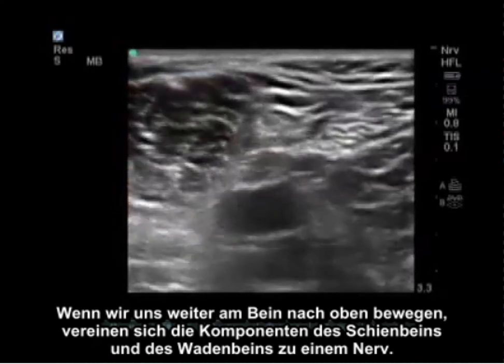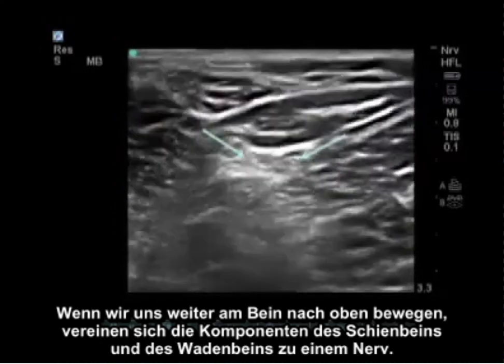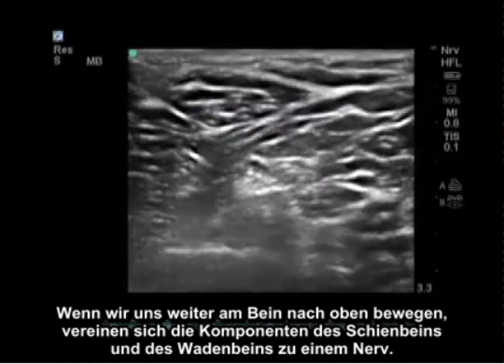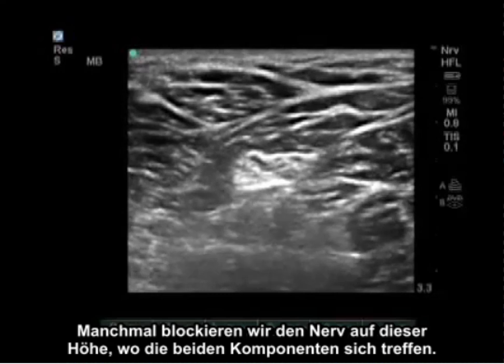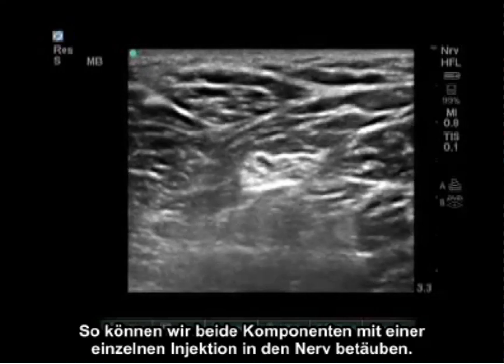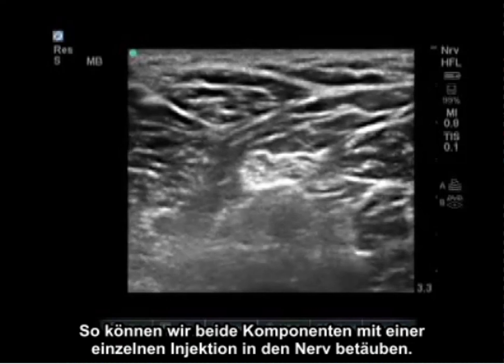As we keep going up the leg the tibial and peroneal components join into one nerve. Sometimes we block the nerve at this level where the two components are joining, which allows us to get both components with a single injection at the nerve.